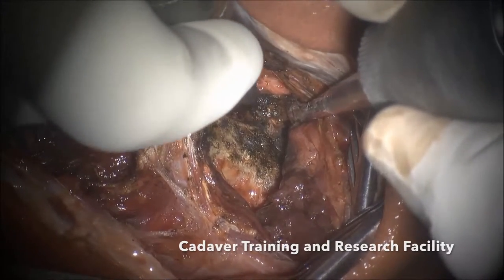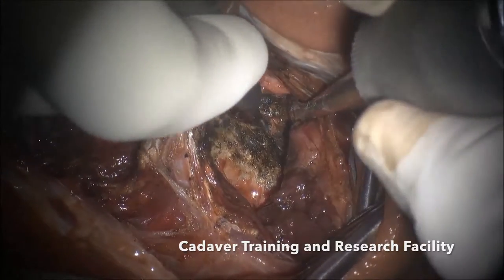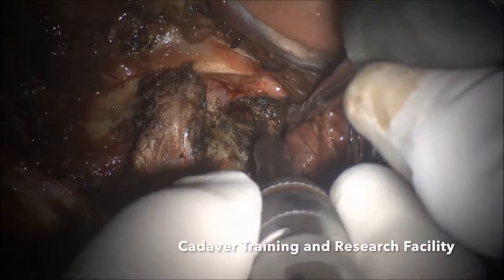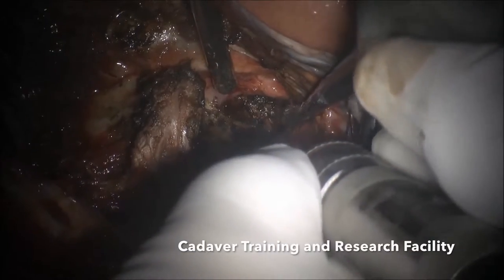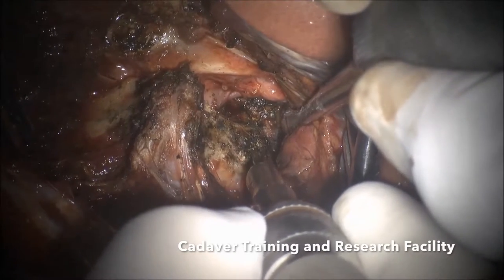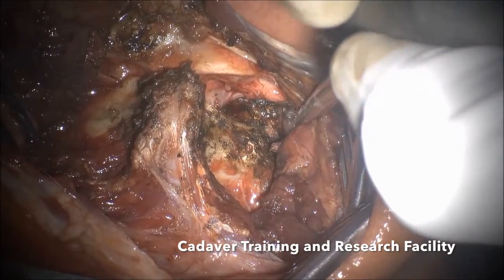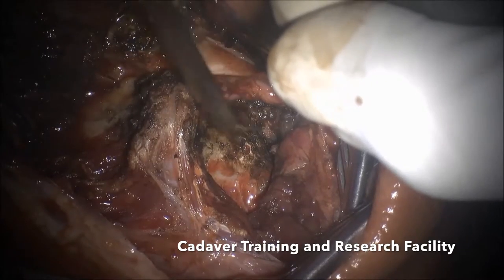Before the road becomes flat — there is an upward slope and a flat portion — just below where it becomes flat, maybe 3.5 to 4 millimeters below that, because that is the diameter of the screw, that is where you start the tunnel, and the tunnel has to go under the house. When you use this you can see it curves inwards maybe 2 to 3 degrees, so naturally your drill will also curve inwards by 2 to 4 degrees. You do not require an image intensifier at all — it is one of the simplest techniques, just put in the length. Once you have put in all four screws then you can take an image intensifier, but understand the technique does not require one.